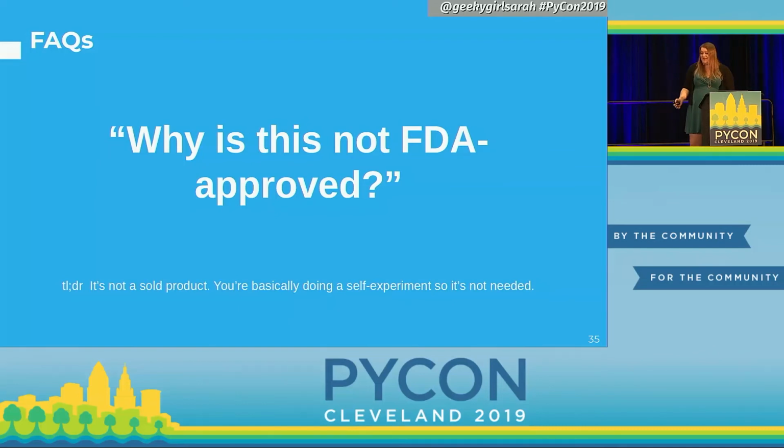Why is this not FDA approved? Complicated question, but the simple answer is it's not a sold product. So you don't go to the store and buy this. It's this hacked together Internet of Things device that I'm using to mess with my body. So since it's a home-built device that only works on me, it doesn't really have to go through the FDA.